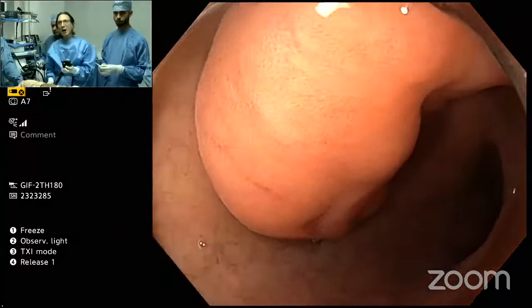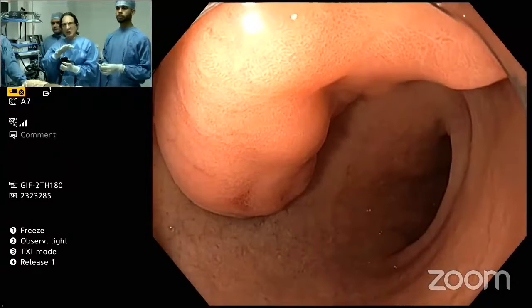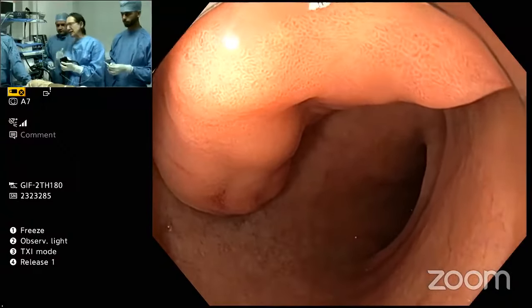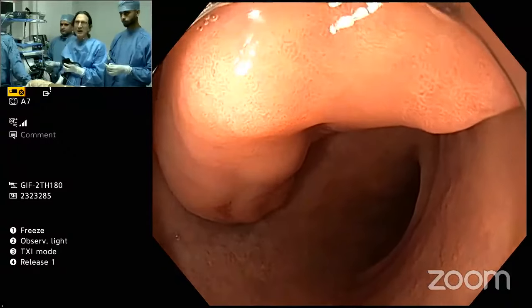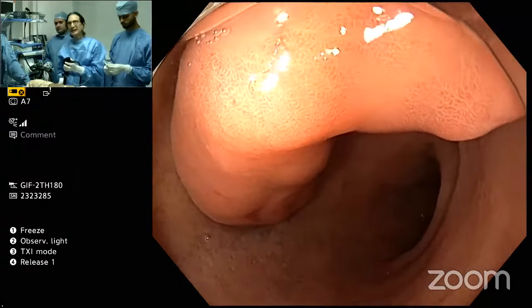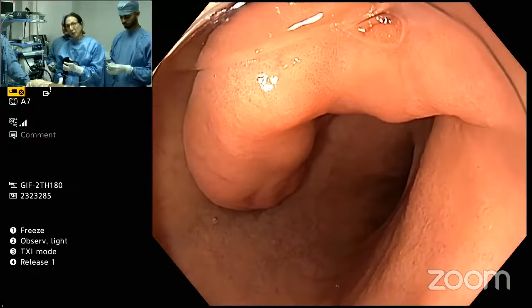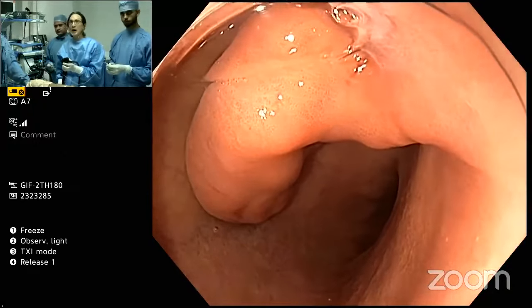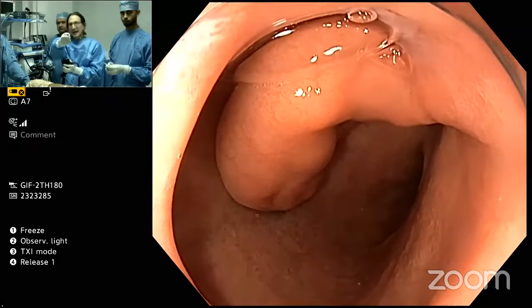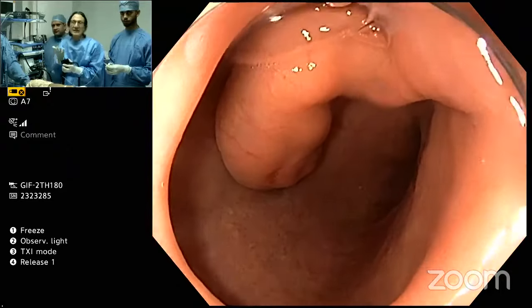Now, how do you treat such a lesion? And I think we'll just bypass or skip doing the endoscopic ultrasound because we'd have to bring the ultrasound. We don't have it in the room right now. So let's just go ahead and assume this is likely a lipoma. Well, how would you remove this? Well, there are different ways you could do this. One option is just throw a snare over it, bring it to the base, and just cut it off. And I think that's very acceptable.